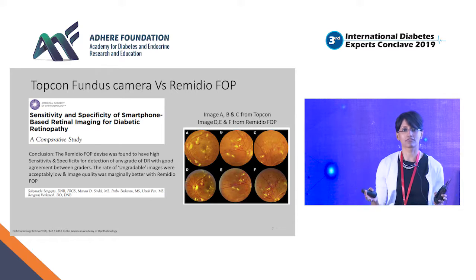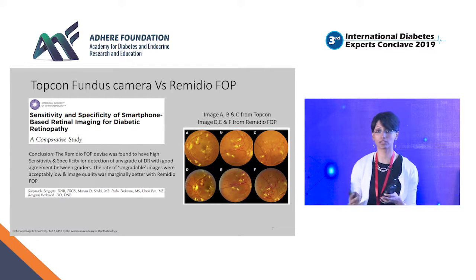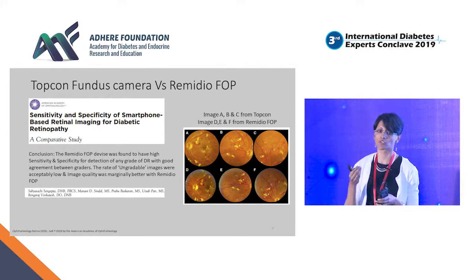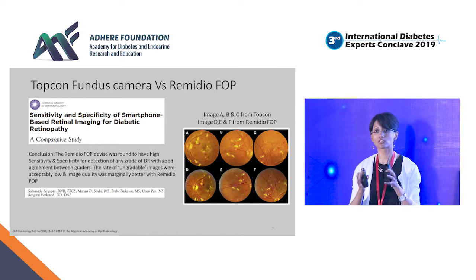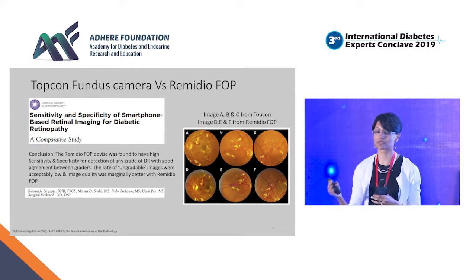But then what do you do with these photographs? If you are not really trained to interpret the photographs, sending it out, then getting it back, that whole process takes time. You need to know an ophthalmologist who is willing to do that. What if you don't? So this is where artificial intelligence comes in, and technology in the last few years has advanced so much that computers are able to help doctors to take decisions. What these algorithms do is they get trained over thousands of images over time from databases, and they are able to pick up patterns in the retina to identify what is a normal retina and what is an abnormal retina. So it's like a face recognition algorithm. Then based on patterns that it has learnt as abnormal, when you feed in a retinal image of a new patient, it can give a diagnosis and say, okay, this patient has retinopathy or this patient has a normal retina.